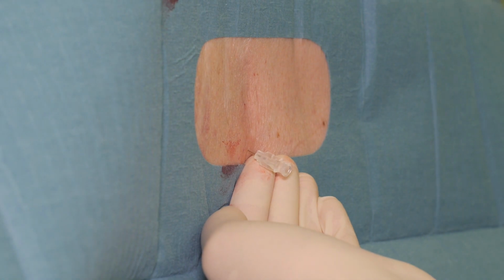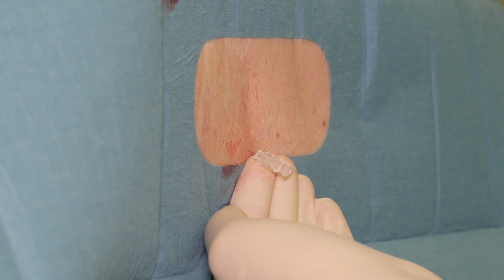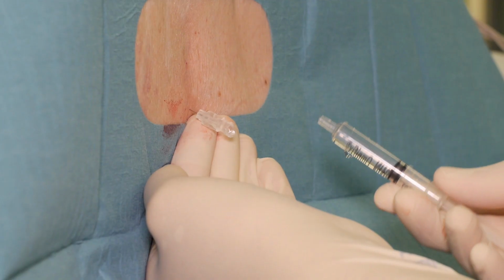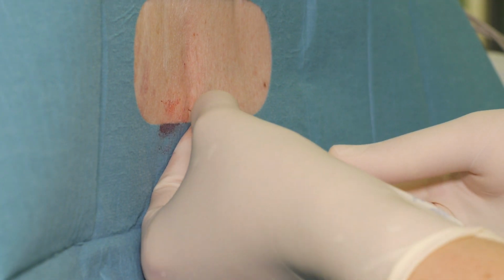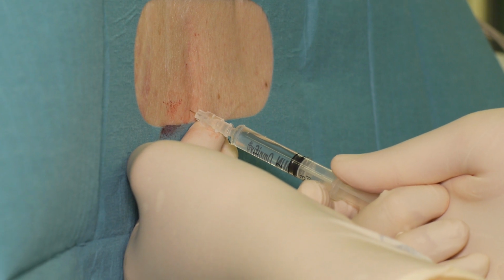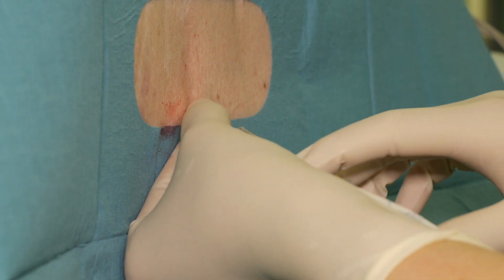In this case, the position of the needle must be corrected, even though spinal fluid would be dripping out of it. If there are no electric shocks, the needle is in the correct site when the spinal fluid is dripping out of it. The anaesthetist confirms the needle is in the correct space by drawing up the spinal fluid into a syringe.